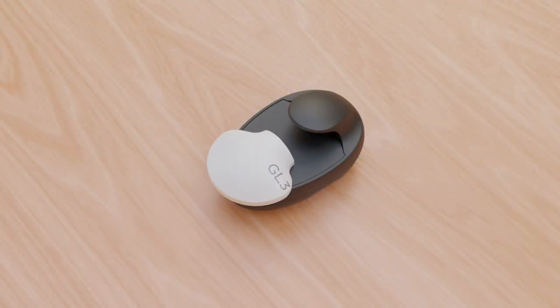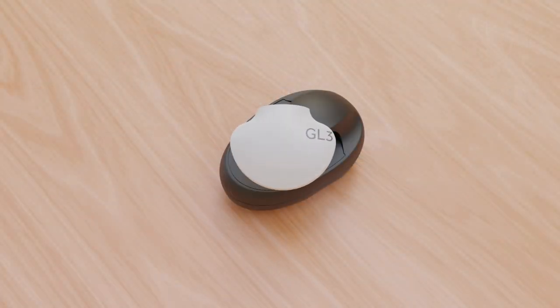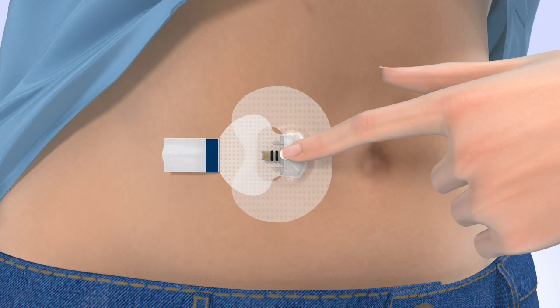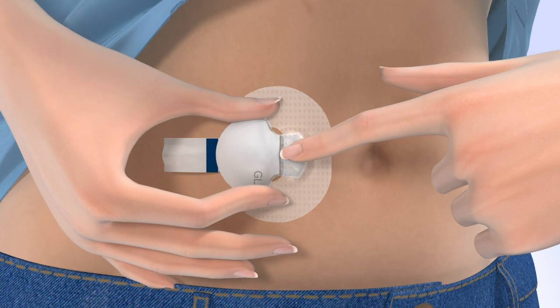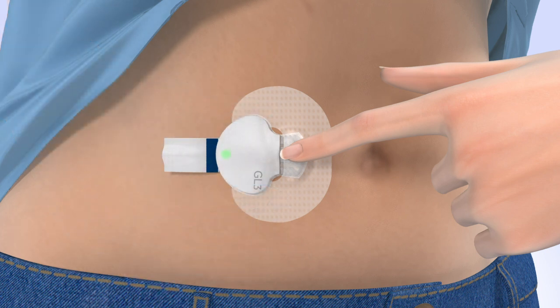Remove your transmitter from the charger and watch for the green light to flash. With one hand, hold the sensor in place. Hold the transmitter with your other hand and push it onto the sensor — it will click when it is connected. The green light on the transmitter will start flashing within a few seconds, then turn off. If necessary, use a mirror to see the green light. Once the transmitter is connected, remove the adhesive liner from the adhesive tab. Fold the adhesive tab over and stick it on the transmitter, being careful not to pull the tab too tightly.